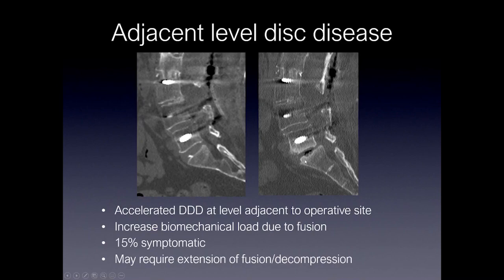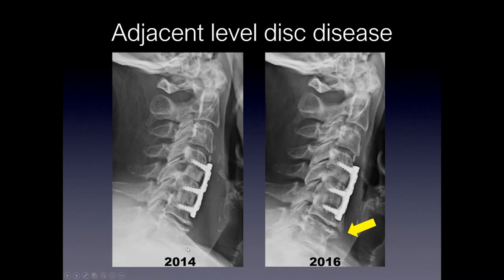Adjacent level disc disease or adjacent segment degeneration is defined as accelerated degenerative disc disease at the level adjacent to the operative site. It's due to an increase in biomechanical load from fusion — when you fuse several levels, the level above or below can undergo further degeneration. In this example, there's a multilevel fusion, and eventually more motion at the adjacent segment results in vacuum disc phenomenon, further subluxation, and endplate sclerosis — advanced degeneration as a result of the fusion. 50% of these can be symptomatic and may require extension of the fusion or decompression. Here, in 2014, the patient had a multilevel ACDF, and arthritic changes at an adjacent level significantly progressed by 2016 due to adjacent level disease.